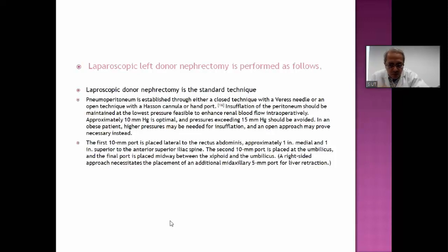Maybe by means of coagulation, you take hold of that bleeding point, or you can put a clip over it, because it will not be possible to stitch it right then and there. A stitch can be placed, but it needs a little more time as compared to open surgery, when everything is in front of you.